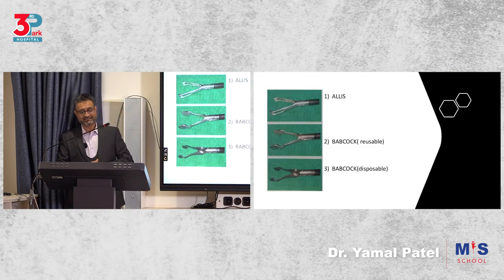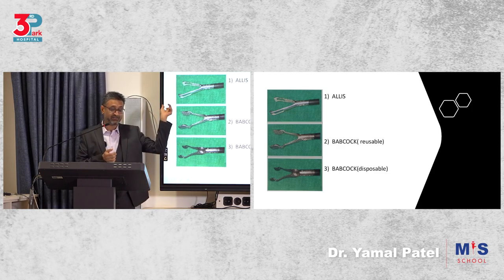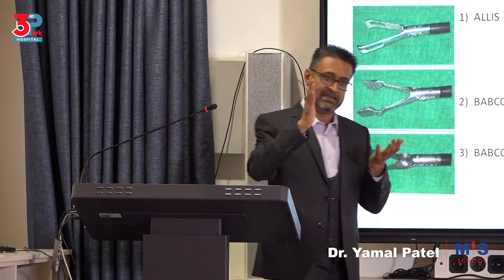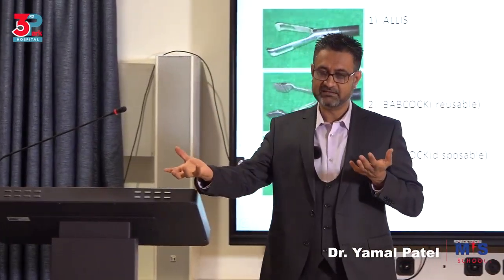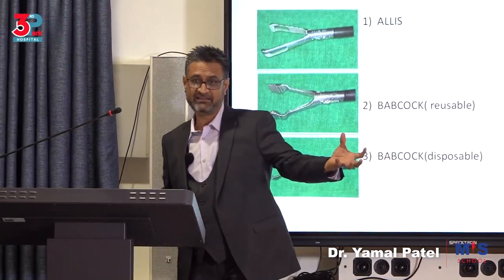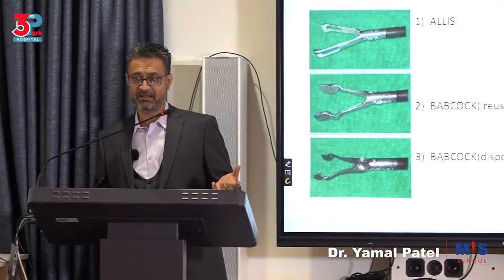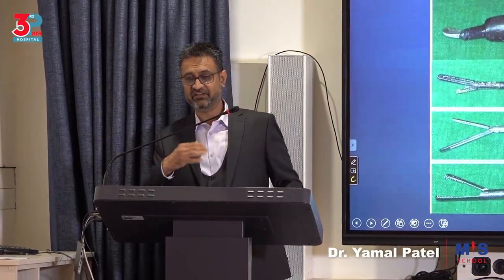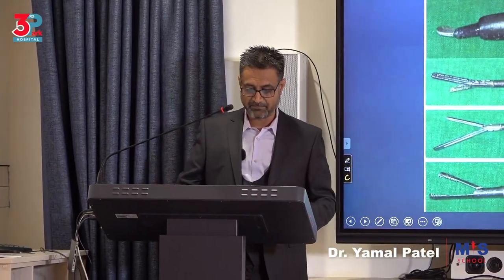We have different graspers, scissors, the hook scissors and then the curved and the straight for the suture. We have different types of graspers, those are dissectors. So these are graspers, the Babcock. We divide them mainly into traumatic, non-traumatic or atraumatic, and semi-traumatic instruments. That's the basic differentiation, and then you have different ones based on what they are specifically meant for.